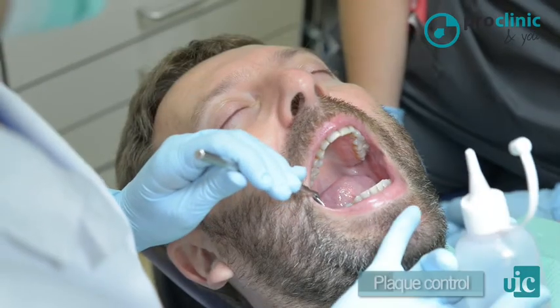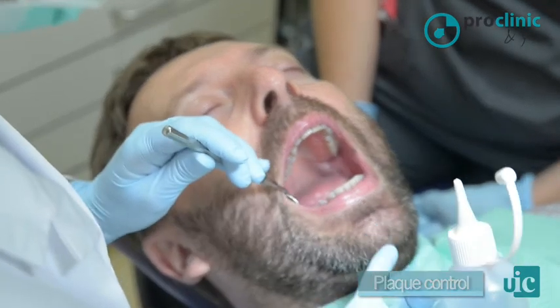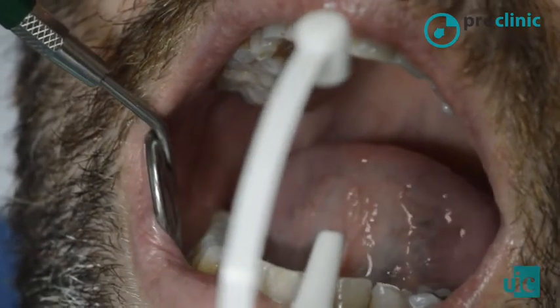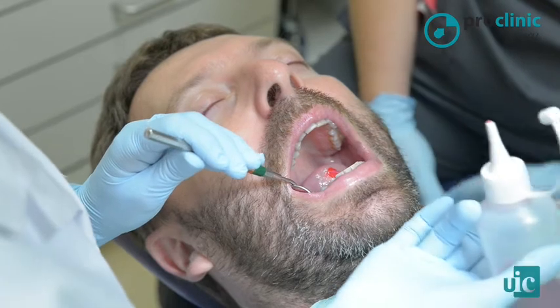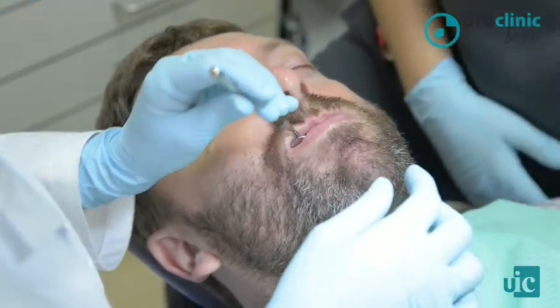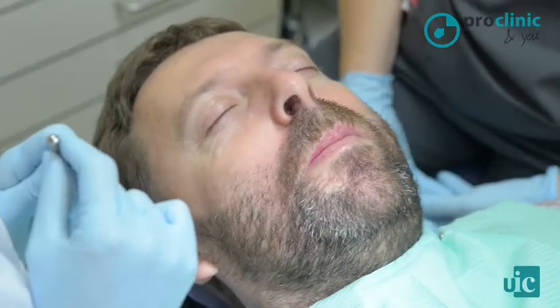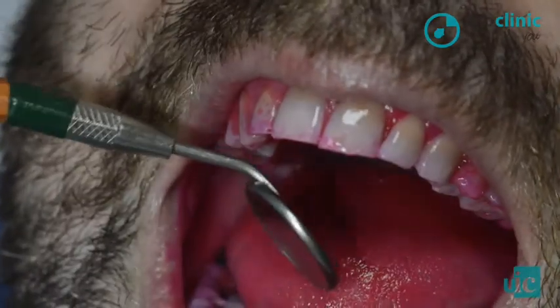We can use a plaque revealer liquid to control the plaque. The patient should place the tip of the tongue toward the palate, and we will apply 3 drops of the revealer underneath the tongue. Then the patient can close the lips and pass the tongue all around teeth surfaces. We should record the areas that are marked.